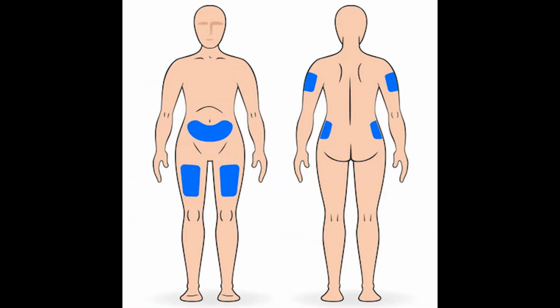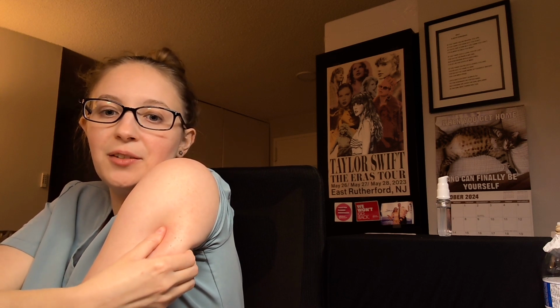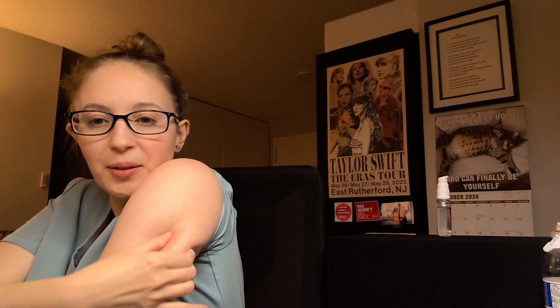For subcutaneous, there's several different places you can inject. I'll go ahead and throw up a picture now. So on the arm, you want to get in the kind of fattier part between your shoulder and your elbow. And it should be in a fatty part where you can kind of pinch and get a little bit of fat in between your hands. A lot of people do this on the belly. There's a lot of fat there, or you can do it on the thigh.